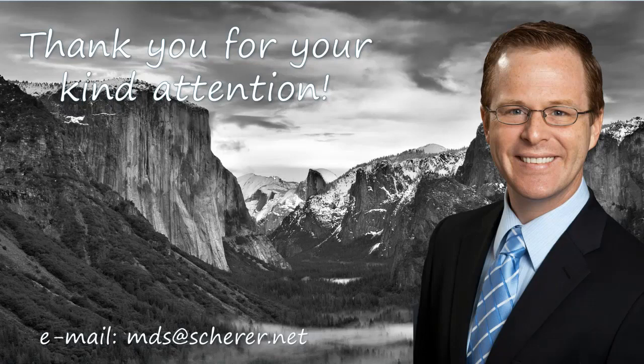I've done it. Is it supported by the literature? No. However, I have done it. Empirically, it can work. However, you run the risk of overloading your implants if there are just 2. So again, the general recommendation is at least 4 implants. Great question there.